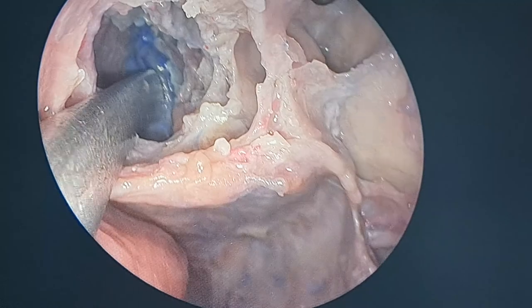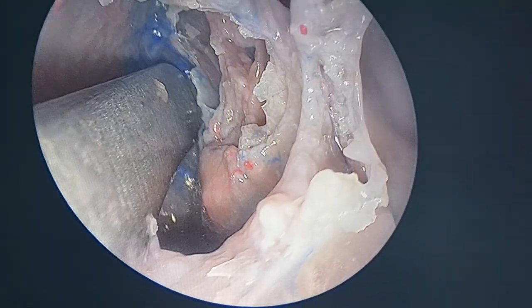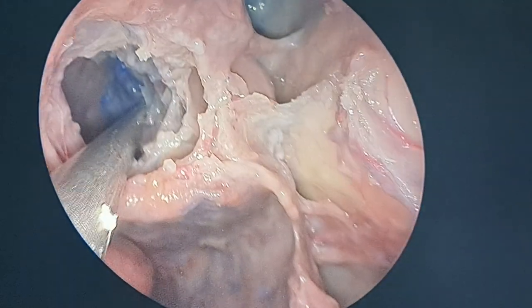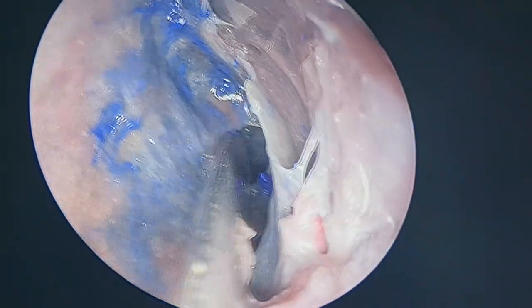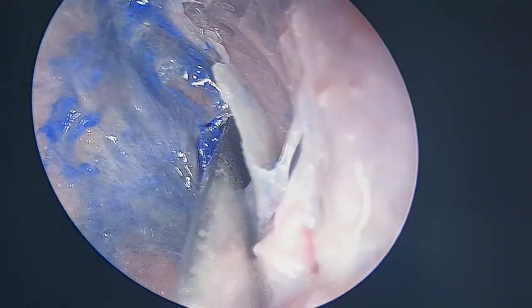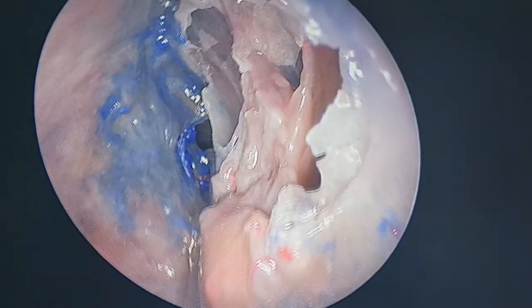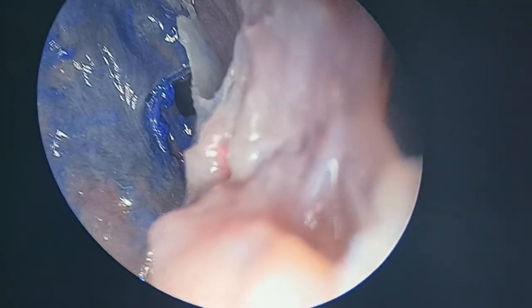If you want to open the sphenoid, glide along the septum. It's not entering, it's gliding along the septum. Gliding along the septum in the maxillary line. See this maxillary line? And I am in the sphenoid. See that? So simple. Not only simple, the safest. The reason being, this sphenoid ostium is never close to the floor of the sinus. It is close to the roof of the sinus.